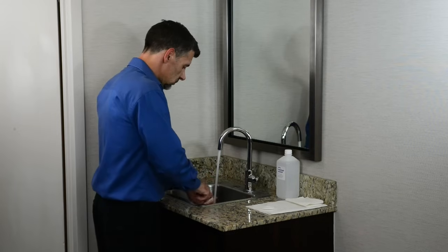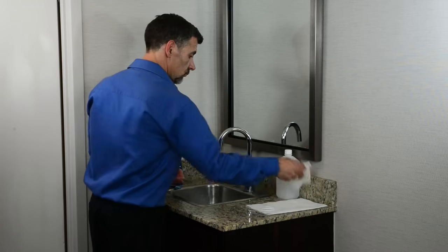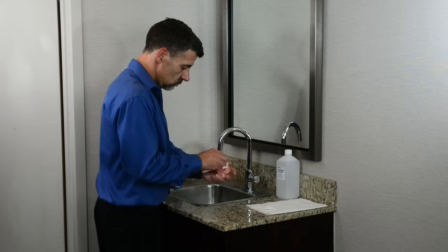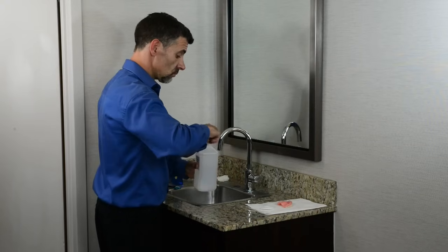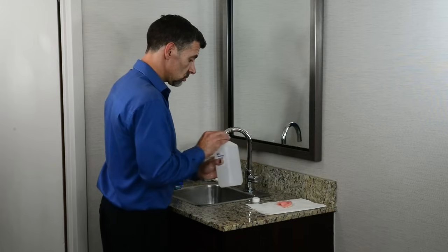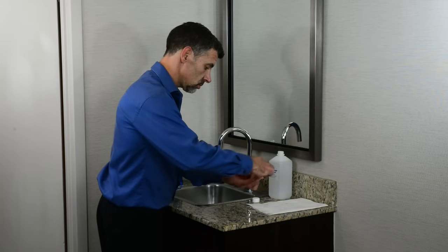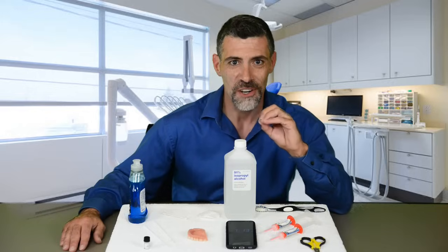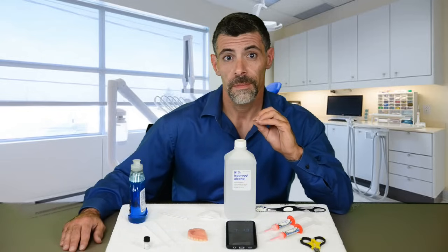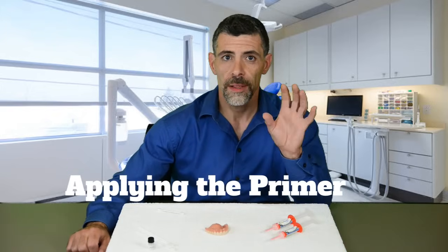Dish soap is the best way to clean your denture in preparation for your reline. Scrub your denture with dish soap and your soft bristle toothbrush, rinse, then dry. To further ensure no residue remains, wipe the inside down with rubbing alcohol. Avoid touching the edges or inside of your denture with your fingers — oils from your fingers will prevent proper adhesion of the silicone.